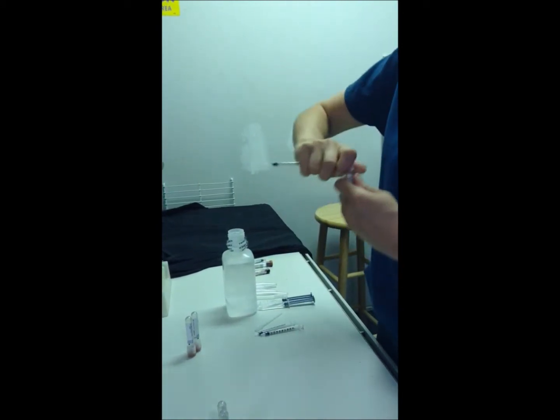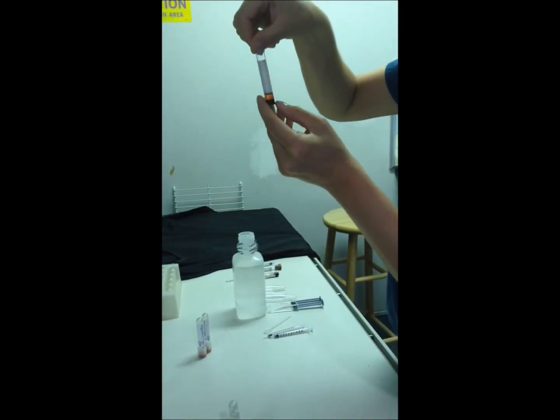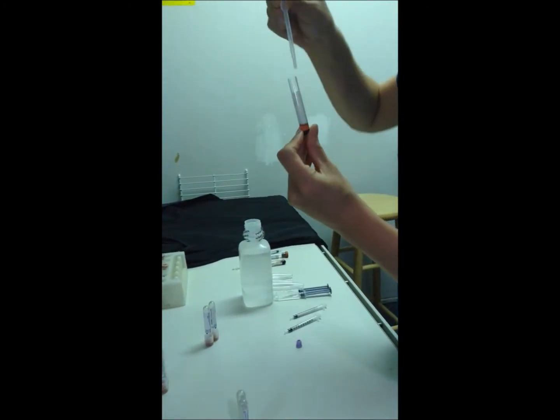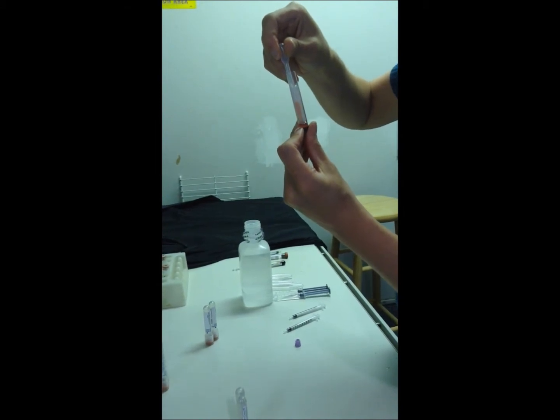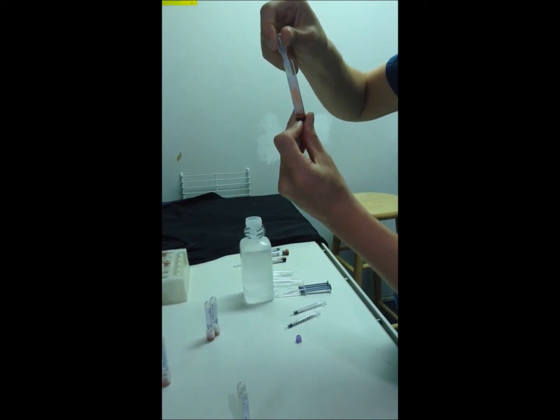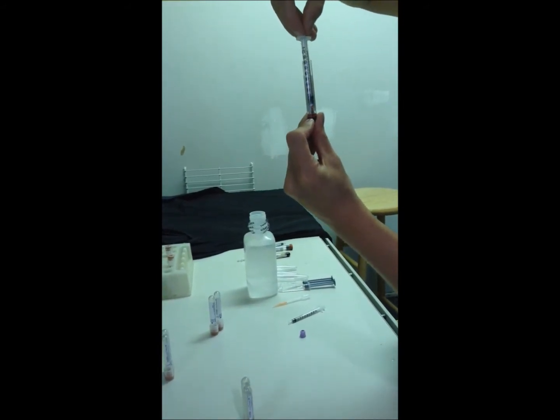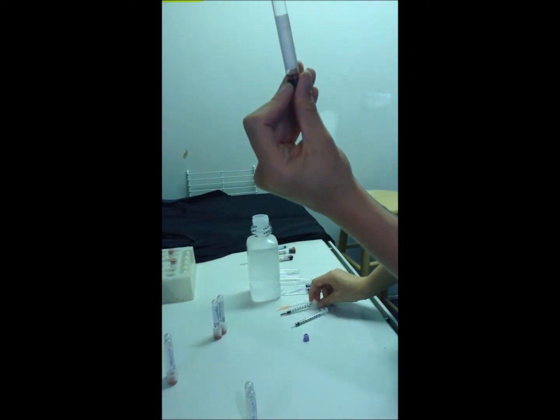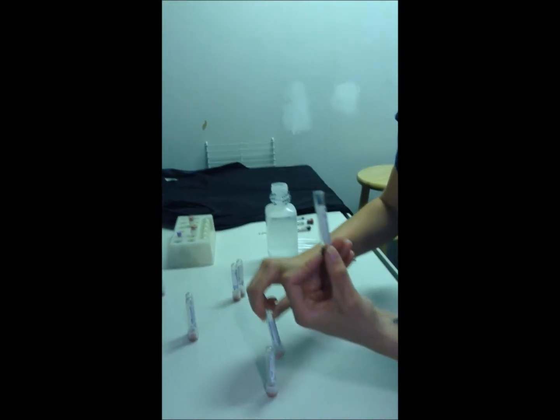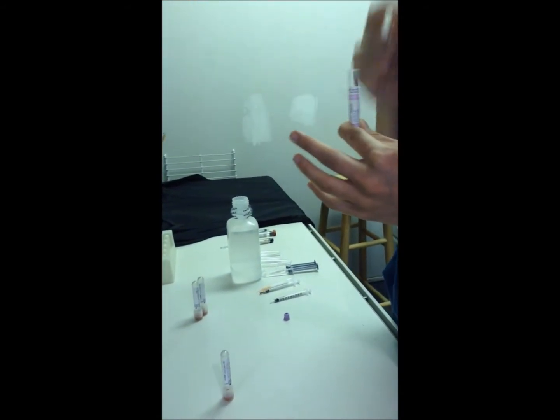And now we're going to decant the plasma out of the lavender top tubes. So this is the plasma here. Make sure you get all of it. Okay, so we only have the erythrocytes in there now, and we're gonna place two drops. This is Ruby's erythrocytes, the donor. We're gonna place two drops of those into a new tube.